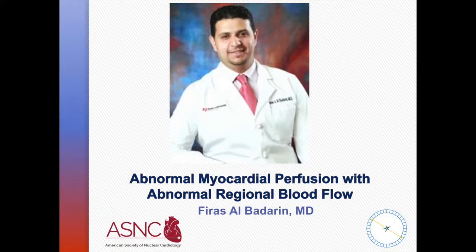If this patient is sent for a rest stress rubidium, her radiation exposure is going to be anywhere between 2 to 4 millisieverts in terms of effective dose. If she instead would be considered for a rest stress SPECT using a conventional SPECT camera with or without advanced post-processing, then we are looking at an effective dose in the range of 11 to 12 millisieverts.